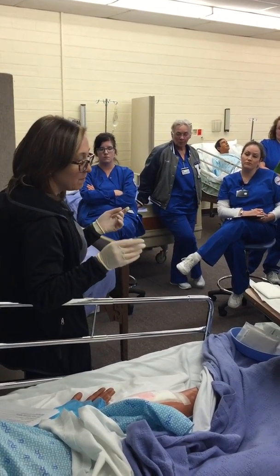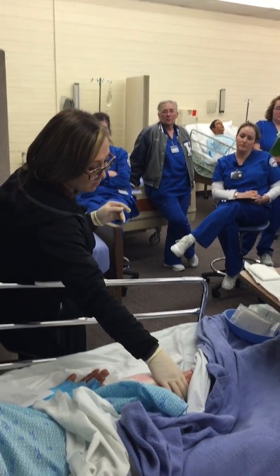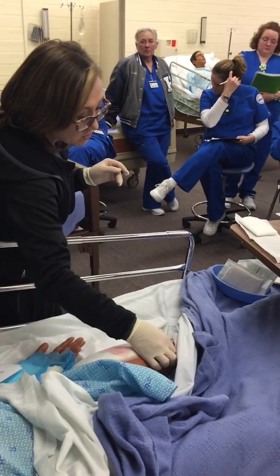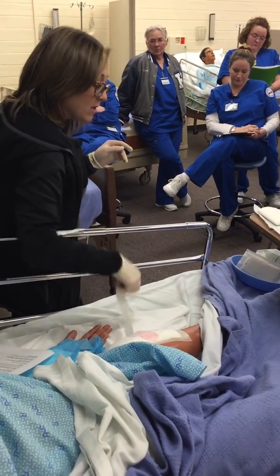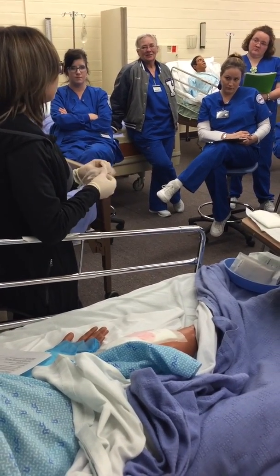So I've got my tape set up and everything. I've got my clean gloves on, and next I'm going to go ahead and take this dressing off. When you're taking this off, don't do like this and pull this off the patient like that, because that's going to hurt really bad.